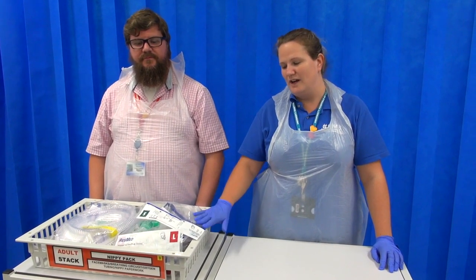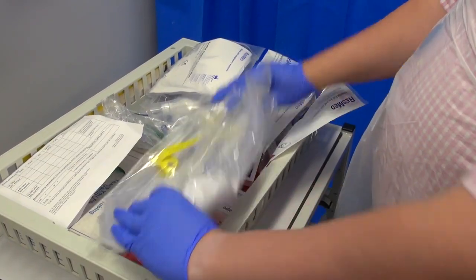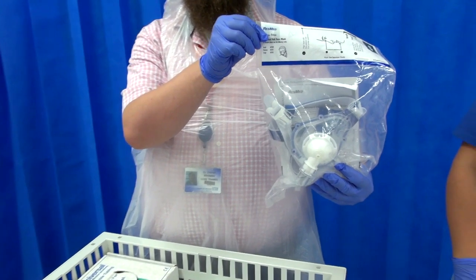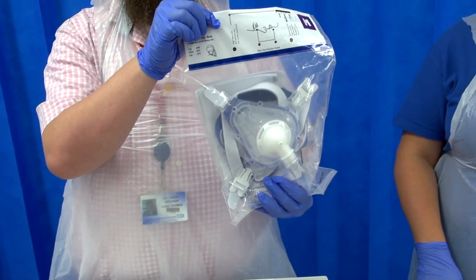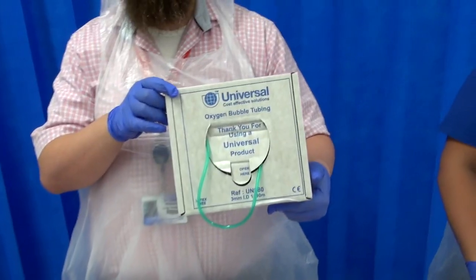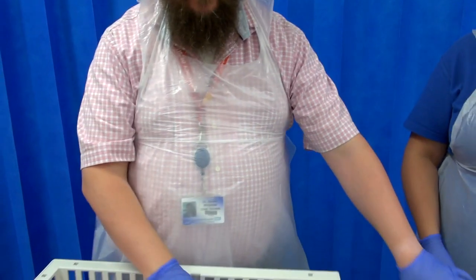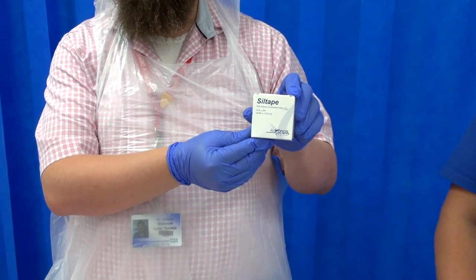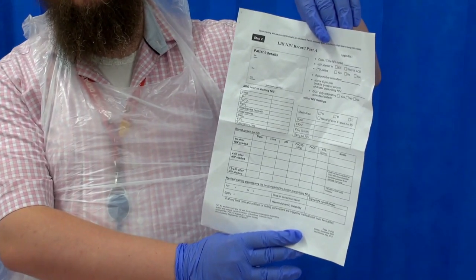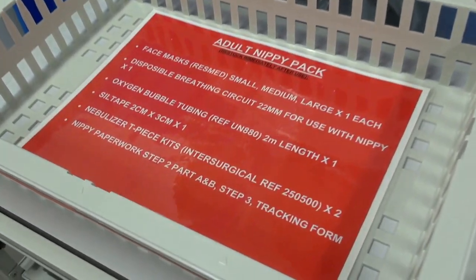In our department we have all of our kit in a tray which is kept in a stack. We would need to go to the stack to get the appropriate tray. In the tray we have the oxygen tubing and filter. We have three sizes of masks that go over the patient: small, medium, and large. We also have oxygen tubing for giving supplemental oxygen, a nebulizer attachment for giving nebulized medication, and for patient comfort, Siltape that goes over pressure areas of the mask. Our paperwork is also kept in this tray, which we fill out when commencing non-invasive ventilation. Everything that should be kept in the tray is listed in the tray, so it's easier to make sure we stock up effectively after use.